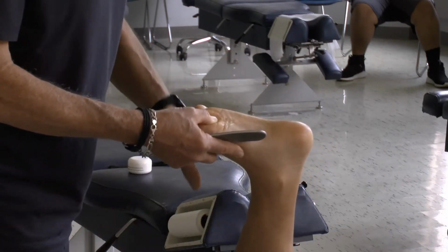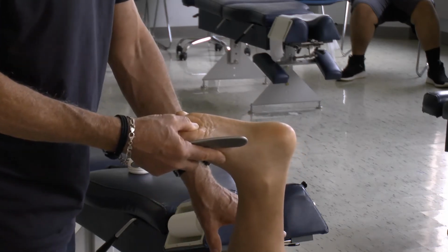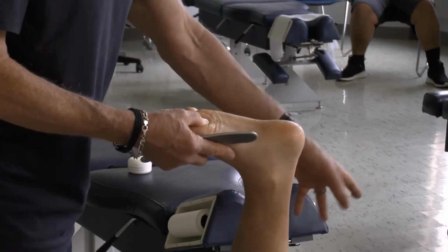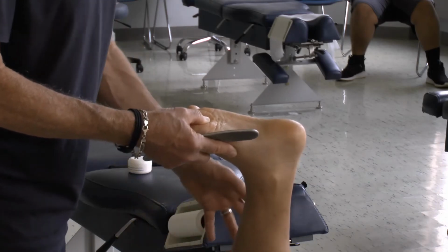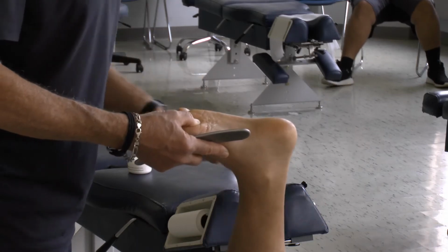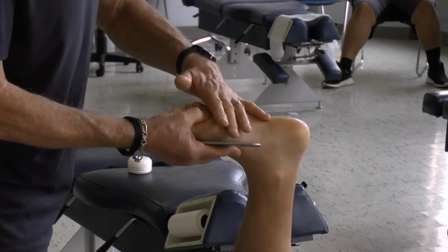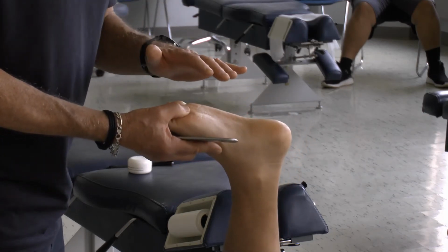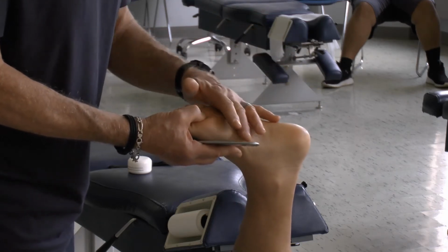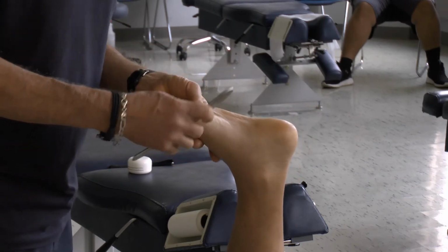So you want to ultimately look at the entire kinetic chain. For example, in a patient who has chronic ankle sprains, there could be some gluteus medius inhibition, and you might have to include strengthening exercises for that, or perhaps stretching out the adductors. I'm just throwing out some examples of looking at the kinetic chain. But right now we're going to concentrate on the actual instrument-assisted connective tissue mobilization of the plantar fascia as part of the overall management of this condition.